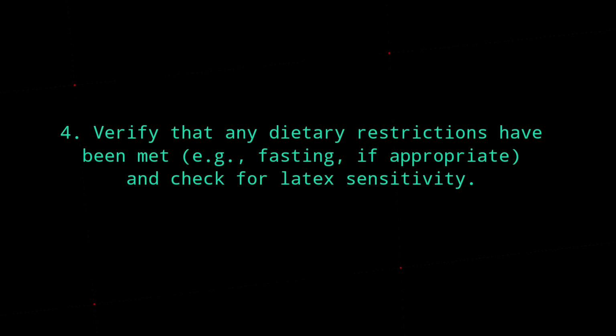Dito, minsan, may mga pasyente na nagsisinungaling, and yun yung nagiging problema sa laboratory. It is also important to ask for latex allergies. If they have latex allergies, we can use tourniquet that don't contain latex.